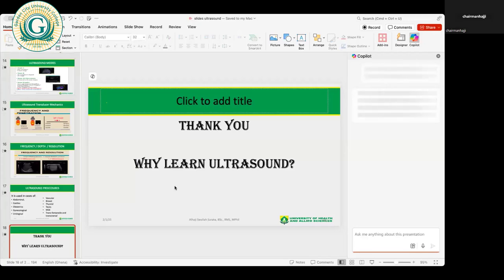There are some of you who have the equipment wasting away at your facilities, whilst you have patients who need their placentation checked, their presentation confirmed, and cardiac activity confirmed. All these things can be done easily within 2 minutes with an ultrasound machine.